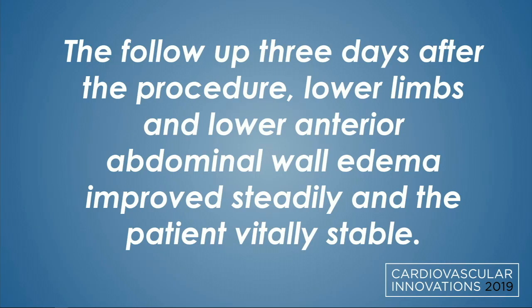Yeah, it appears from the MRV it's just compression. Even from the venography, it's just compression from outside. And here you covered the renal veins with the stents, right? Yes, we are covering the renal veins. You see there is a gap between the two stents, but some authors describe using a stent inside the stent, just for crossing.